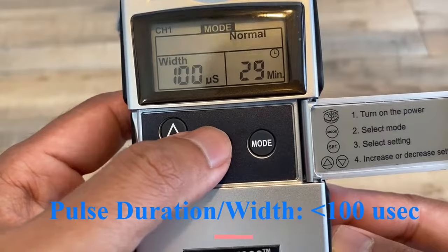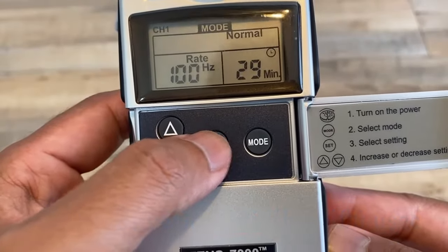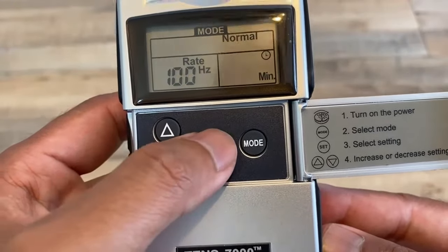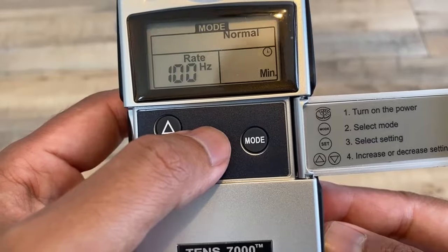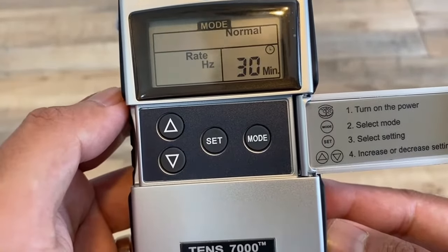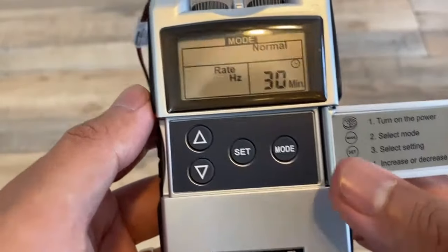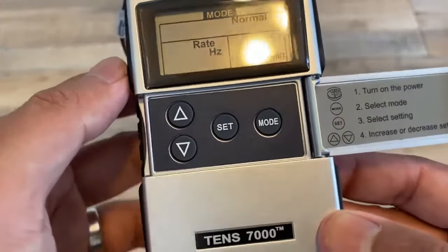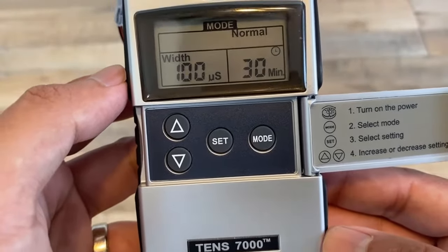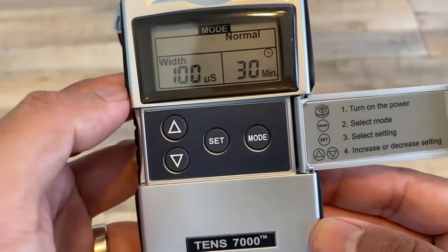If you hit 'set' repeatedly, you can toggle to the time and go back and forth as well. To get out of set mode, most of the time if you just leave it alone the flashing will stop on its own. But if you're impatient, you can hit the mode button or turn it off and back on. If you give it about five seconds, the setting will go away and you're back to normal.